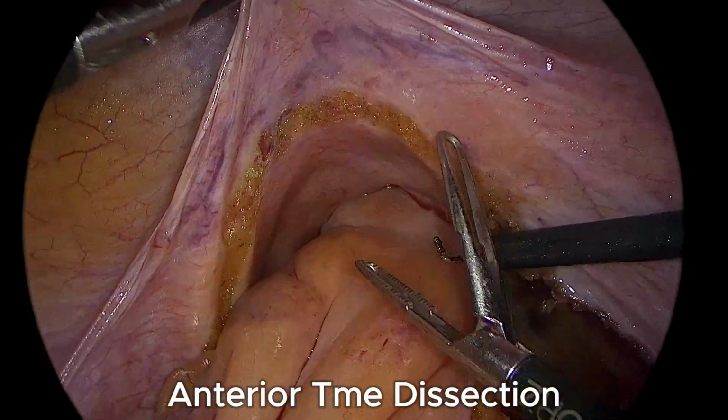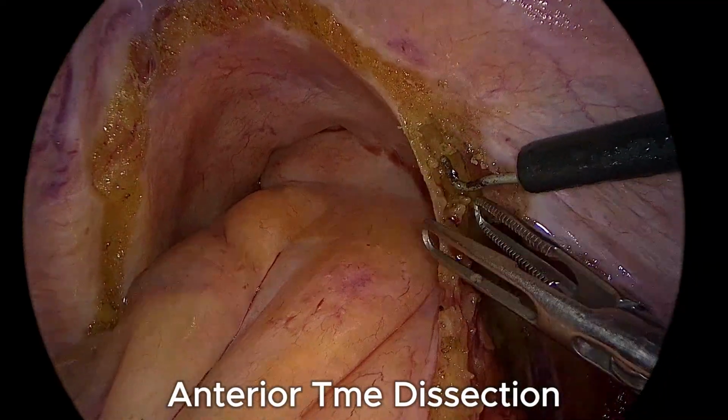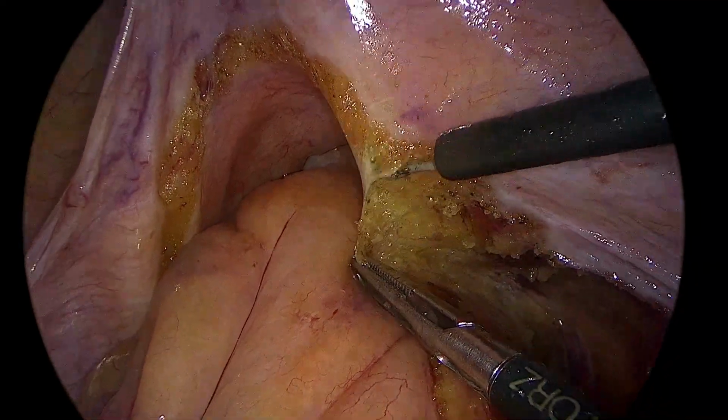Here you can see we are doing anterior TME dissection and anterior TME plane was opened up.